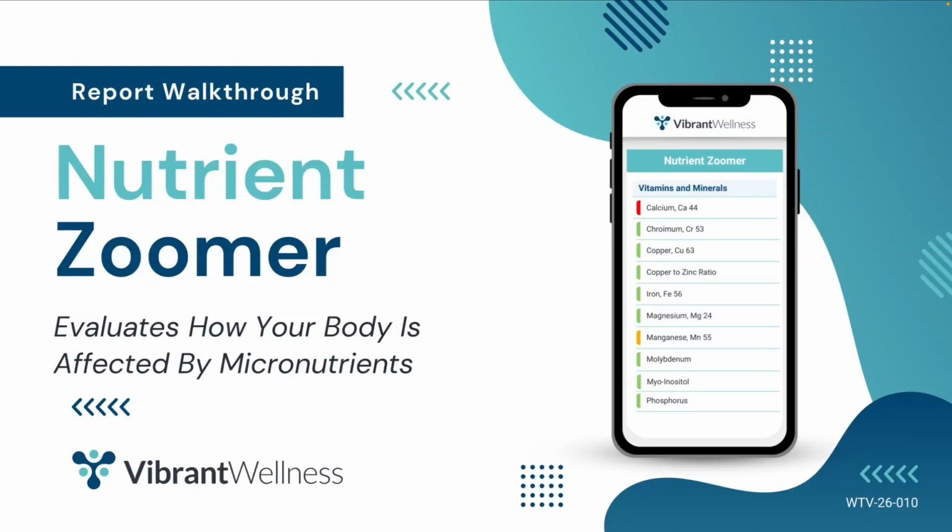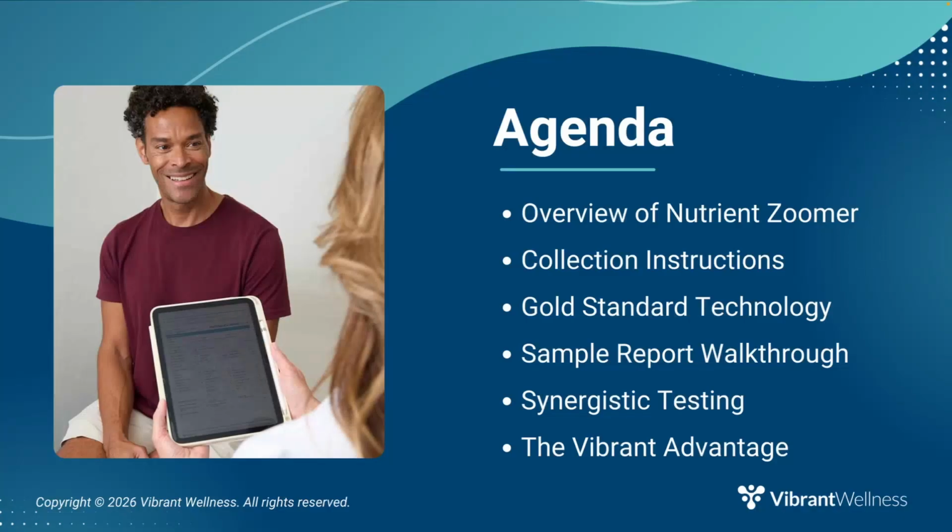In this video, you'll get a quick overview of Vibrant's Nutrient Zoomer. I'll start with an overview, including explaining the two panels included in the test. Then, I'll discuss collection instructions and explain the required tubes. Next, I'll walk through each section of the test, highlighting key features.